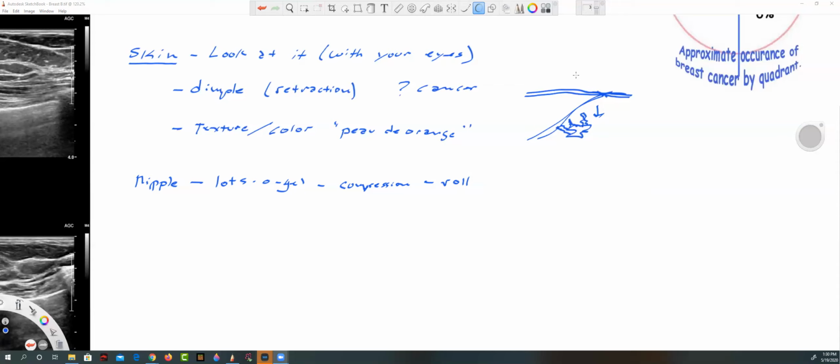In a professional way, you need to see underneath the nipple. Here's my phone, it's my transducer. Nipple sitting here. You can come up next to it, but all you're going to do is push it to the side, and you might not be getting directly underneath it, which is why I advocate using the back of your fingers. Two reasons.